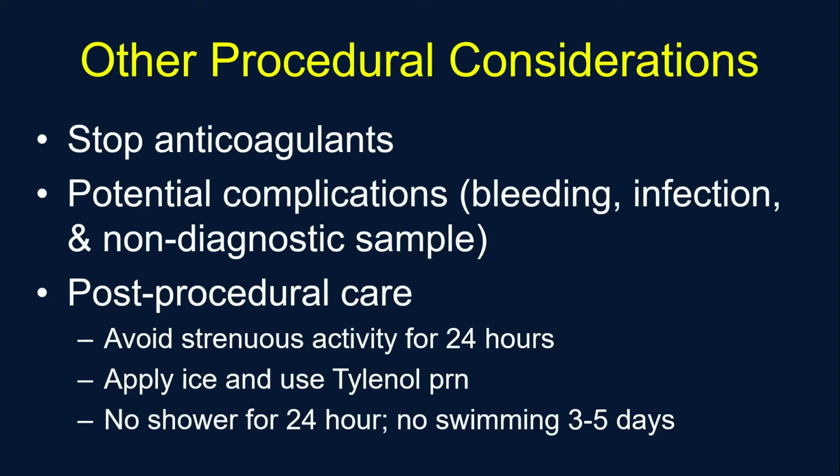Other procedural considerations. If somebody's on anticoagulants, ideally you probably want to have them off of it for the biopsy. But as I said earlier, you can do it on Coumadin. You just really are going to be holding pressure for quite some time, and they're very likely going to have a hematoma. Aspirin, we no longer discontinue aspirin. We have them on aspirin all the time, and even non-steroidals I don't even care about. I have not seen any difference, but I do worry about Plavix.